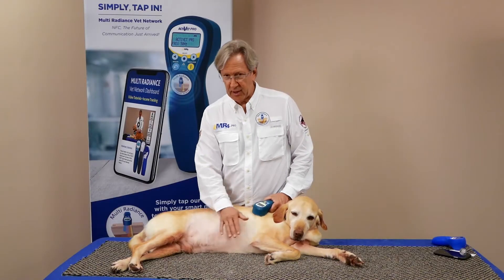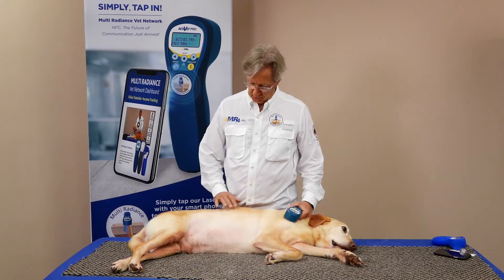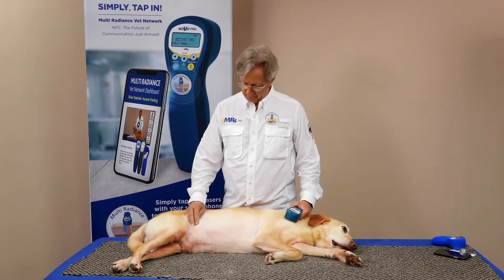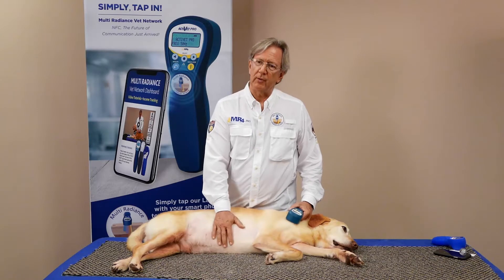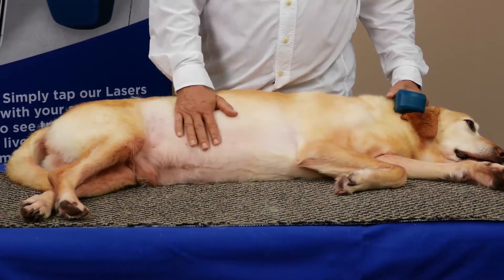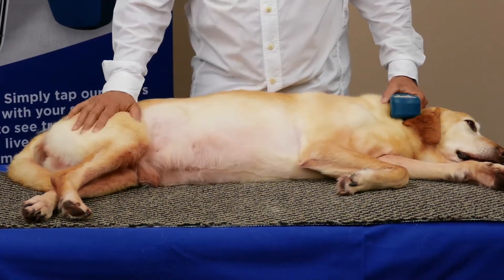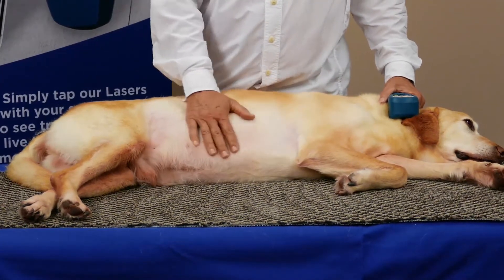Hi, Mark Strong back with you. Chance is with us today and we're going to work on an arthritis condition. This is such a common condition in your vet practice. We've been working with him for a few minutes now and he's just really with the program.